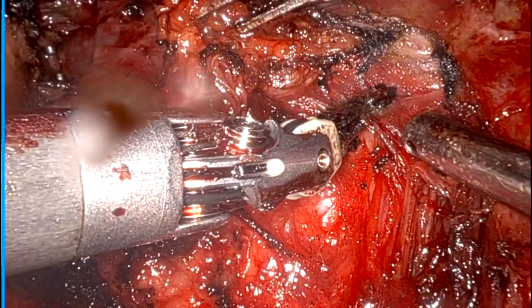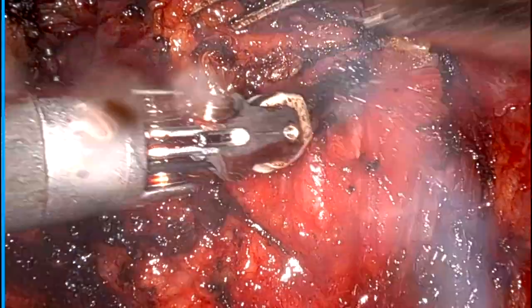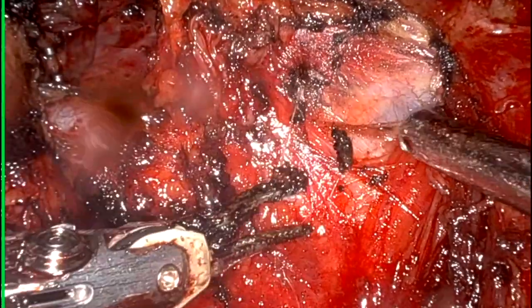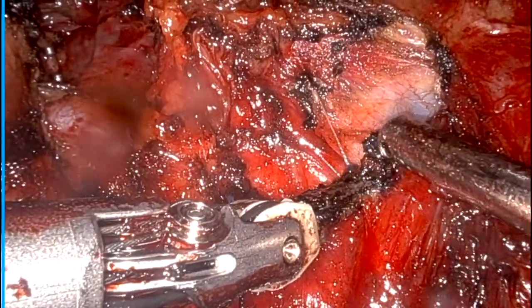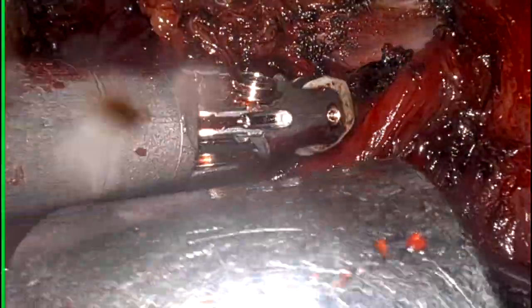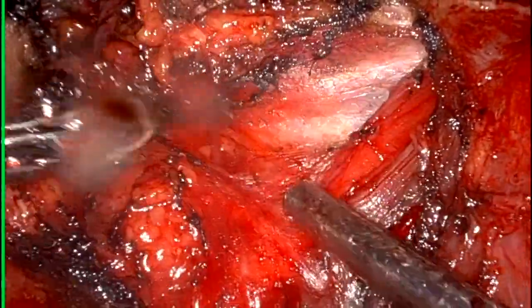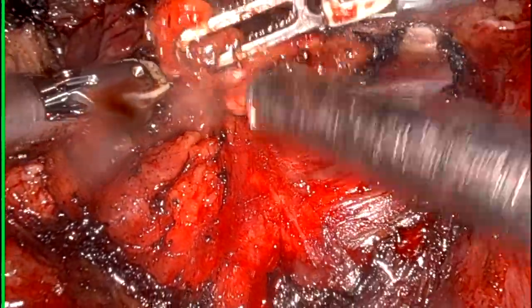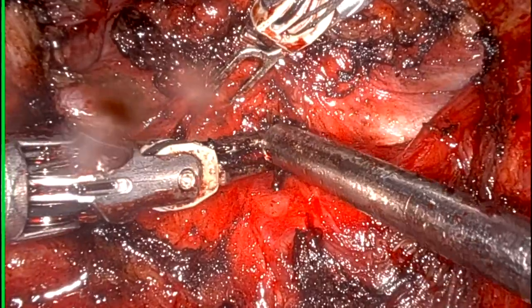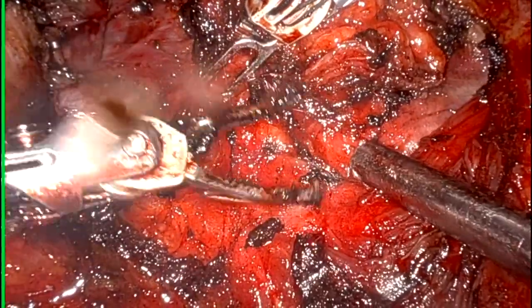Till now we were not retracting sternocleidomastoid muscle, but now my assistant has taken up the retractor and started retracting sternocleidomastoid muscle. Now IJV is visible. And this is the retractor. During entire level 2 and 3 dissection, we will keep changing the position of this retractor. And I want you to notice that change.